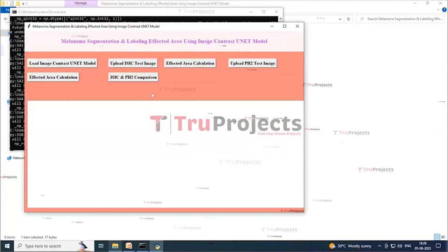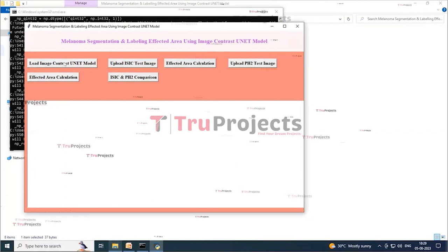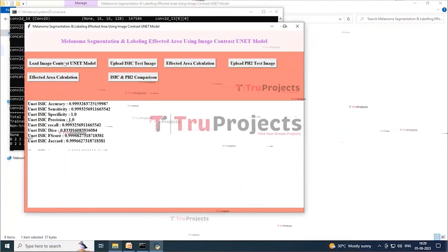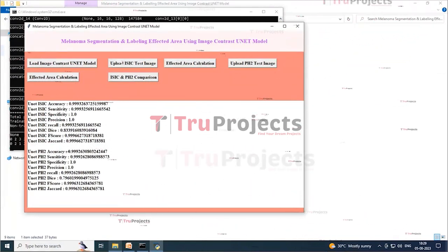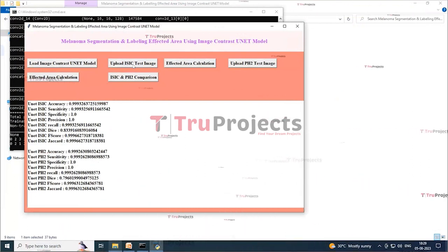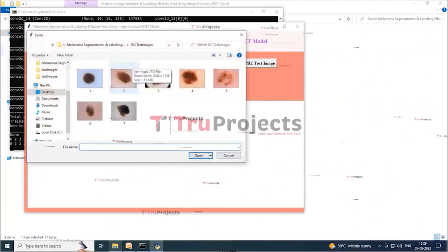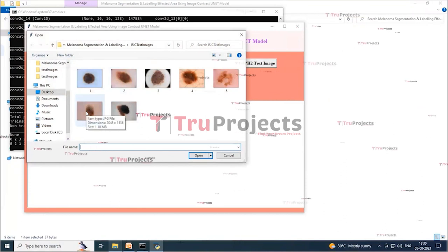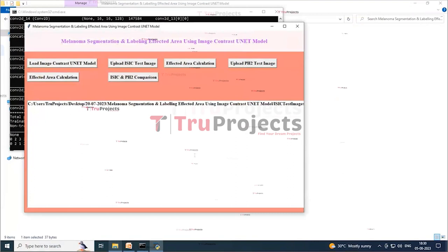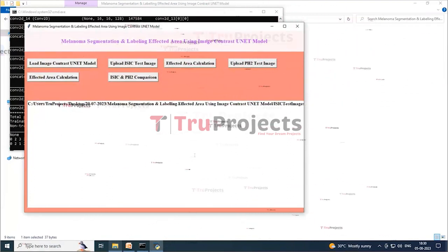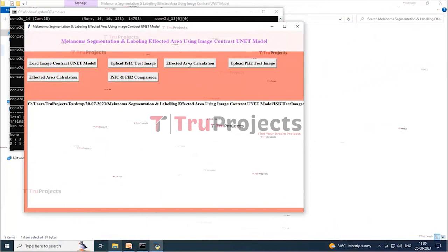After double-clicking the run.bat file, the graphical user interface launches for interacting with the program. Click the Load Image Contrast UNet Model button to load the UNet model. The screen confirms the model is loaded and shows experiment results on both datasets. Next, click the Upload ISIC Test Image button, select an image, and click Open to load it. Then click the Affected Area Calculation button to get the output.